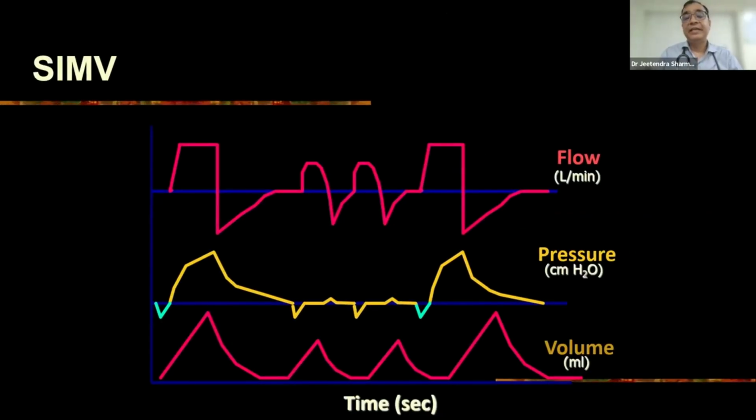Now SIMV, as I told you, SIMV can also be of two types. SIMV is the pattern of how the triggering is there. You understood in the initial ventilation analogy. This is the same analogy where the person residing in the room has a water cooler beside. Water cooler means spontaneous breathing. So SIMV is basically mandatory breath. In between, spontaneous breath is allowable, and spontaneous breath is a spontaneous one. It cannot be categorized as a volume preset or a pressure preset. But mandatory breath you can categorize whether it is a volume preset or pressure preset.